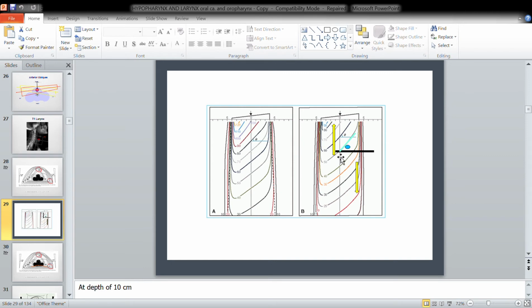If you increase the wedge angle, what would you do? You will make a large difference between the point here and those under this end here. So if we increase it from 35 to 45, what happens is that instead of the 50% being here, this will come down and this point will go up. So we are increasing the wedge angle, yes, something like that. This point will go down, so the isodose line will shift toward the thin end of the wedge.